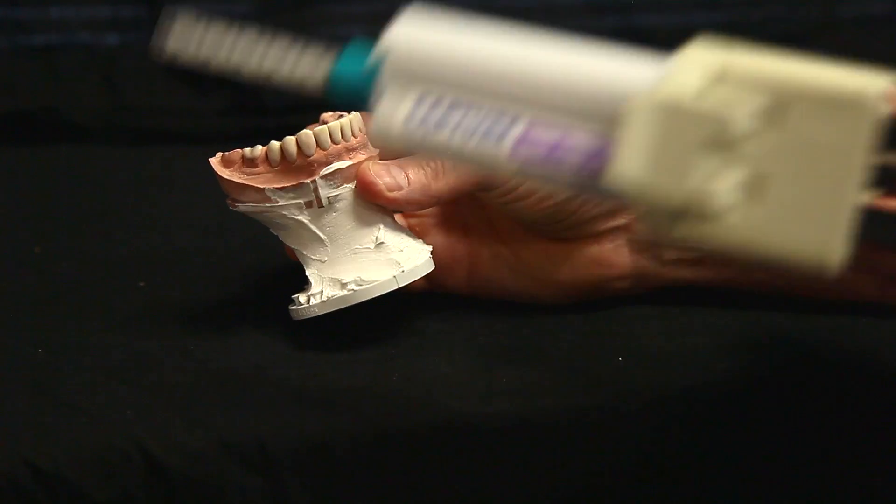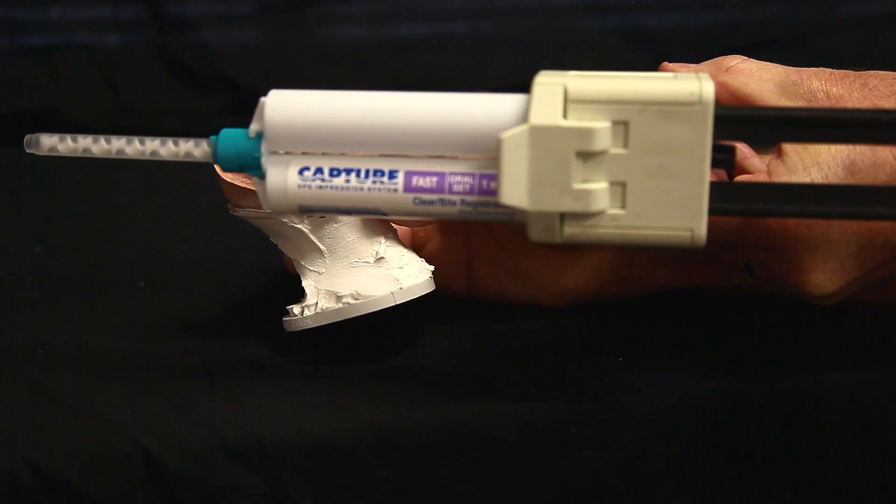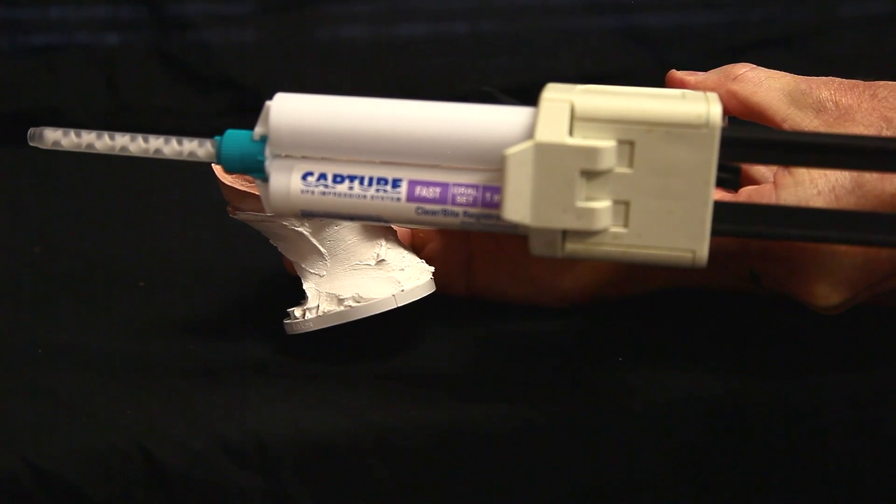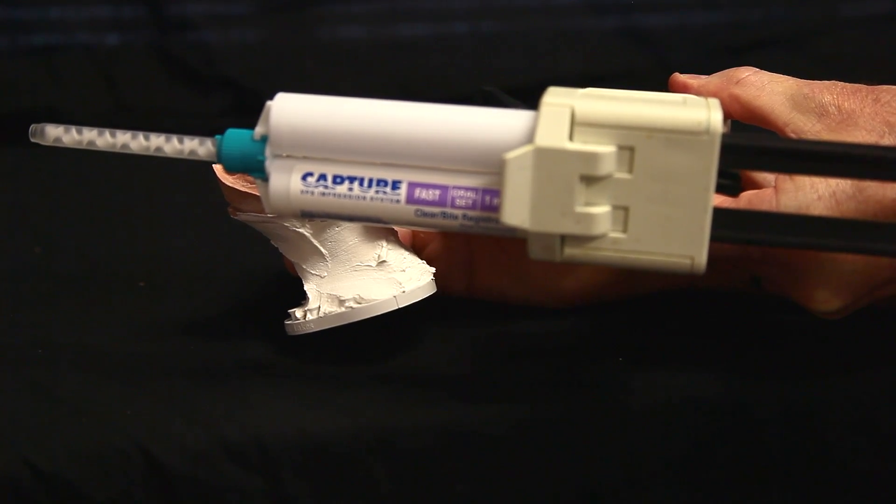One of the materials we're going to be using is a material called Capture. You can get this at Glidewell. It's a clear polyvinyl, so let's go ahead and make one.